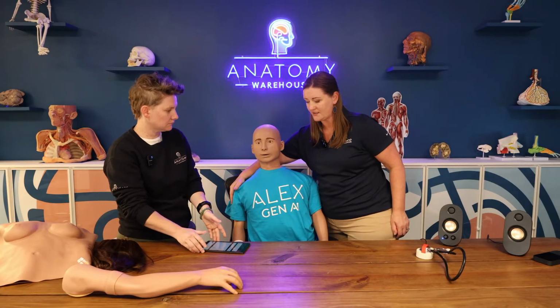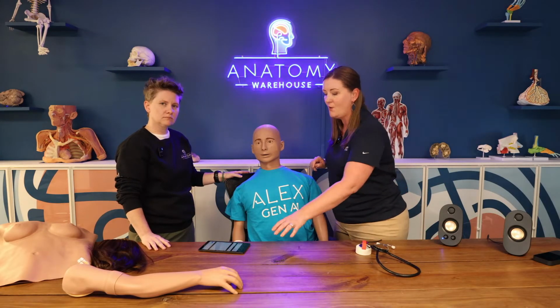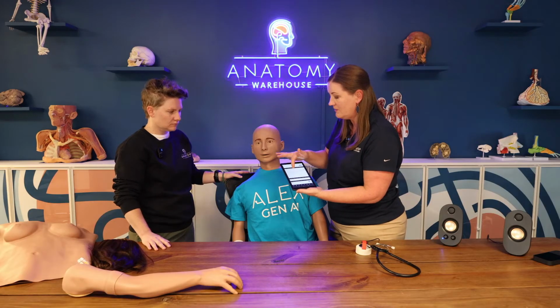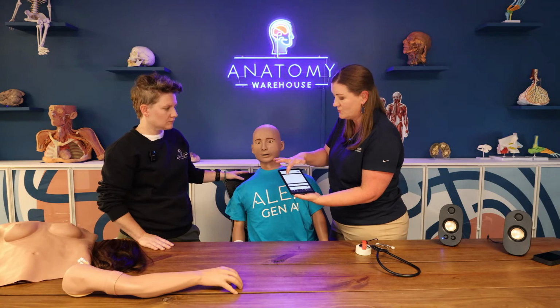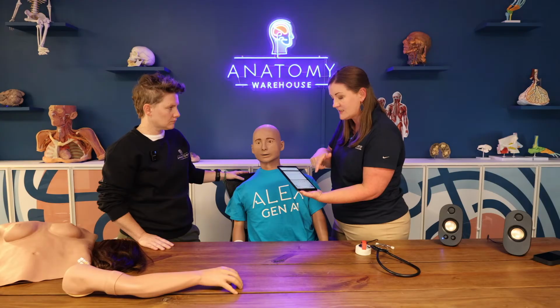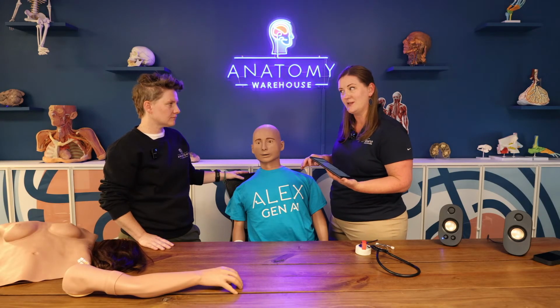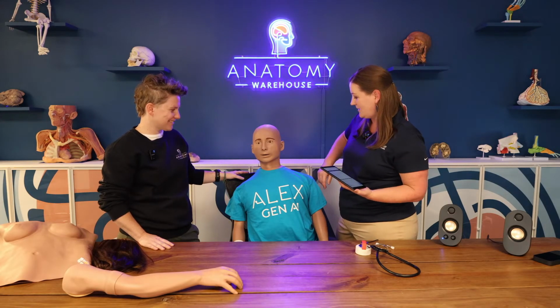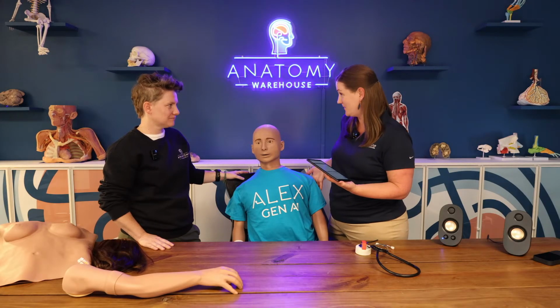Okay. So Andrew is a little confused, I think, from his car accident. And we can still do the same vital parameters. What we can also do in the sound settings within the simulation software platform is some very basic things too. So we can have him clear his throat. There's a gasp, there's some other things. The key with Alex in the software is ensuring that the internet stays nice and solid and connected. So currently, I think Alex gave me a double buzz, which means that he has dropped from the internet currently.